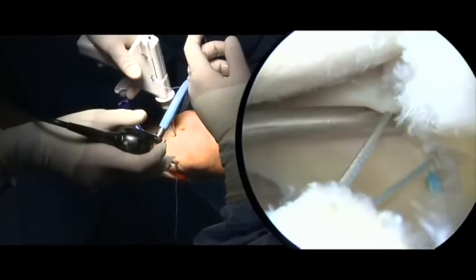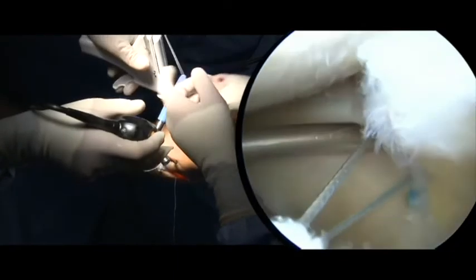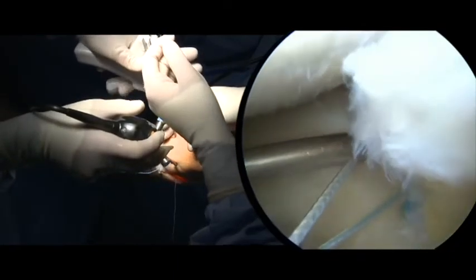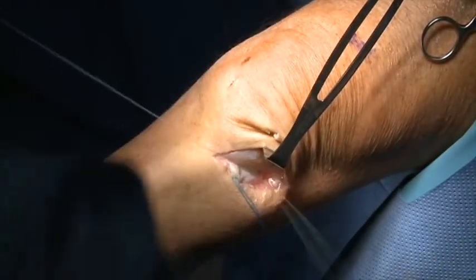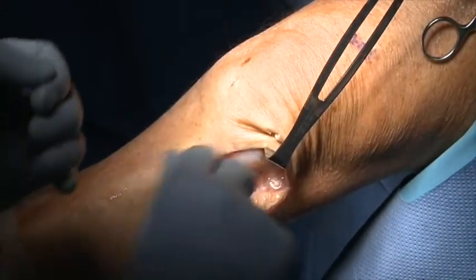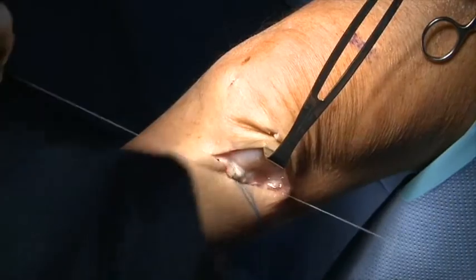The restoration of the shape and stability of the repair is confirmed by visualization and probing. Standard inside-out meniscal sutures are used to further strengthen the construct.